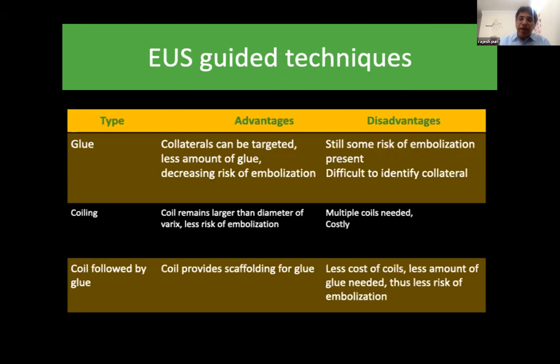Now we have 3 things: EUS-guided glue injection, EUS-guided coil injection, and EUS-guided coil followed by the glue. So what is the concept?